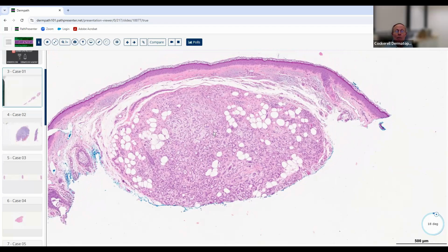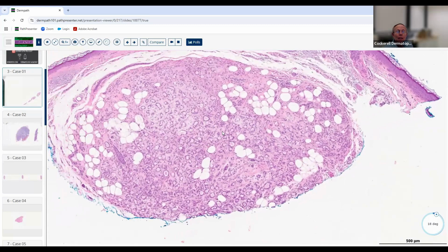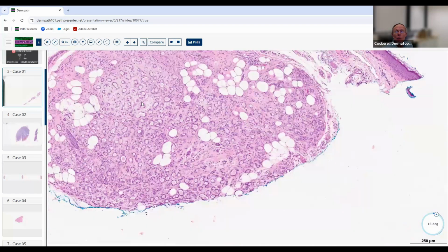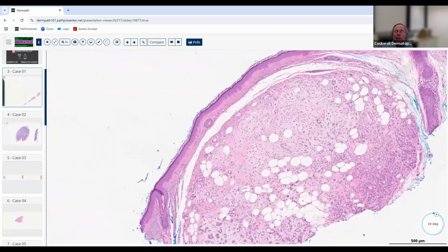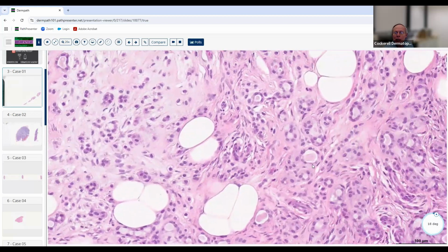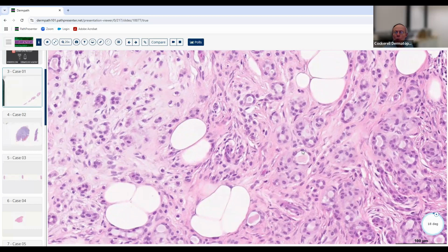So at this power, you can begin to make out that there are some epithelial structures here. They're little small ducts. And the stroma also has this pallor, kind of a bluish gray color to it. So we all know that whenever we see bluish gray in the skin, we start thinking of things like mucin, or extracellular lipid, like an eruptive xanthoma can look bluish gray. And so go to higher magnification, and now we see these are nice little beautiful ducts with these cuboidal cells, with these nice little round nuclei. Some of the cells have some clear staining cytoplasm, others have almost no cytoplasm at all. So that really looks very much like an eccrine sweat duct or possibly part of the eccrine sweat gland. And as you know, the clear staining cells are the ones that contain the glycogen. They're the metabolically active cells.